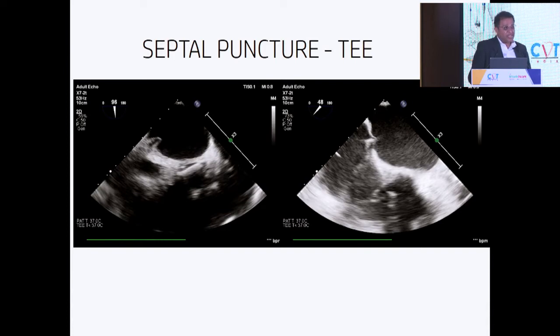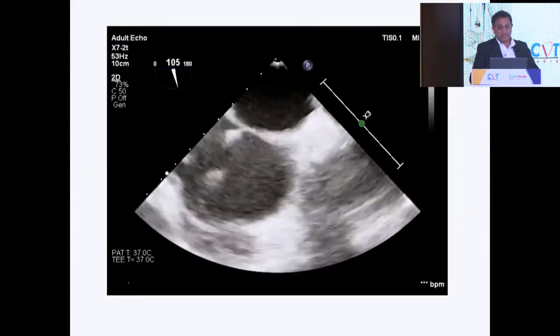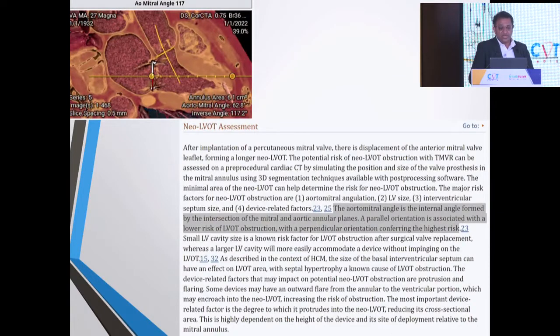Height in these cases really doesn't matter. But of course, you should not go too high, otherwise it gets difficult to get the valve across. So the apex distance to the puncture site is important. Once you've done that, we proceeded with the TAVI. And LVOT has already been discussed, what should be your LVOT, and anything less than 200, now even 180, 150 is acceptable. And the aorto-mitral angle: the more parallel it is, the less the risk of LVOT obstruction.